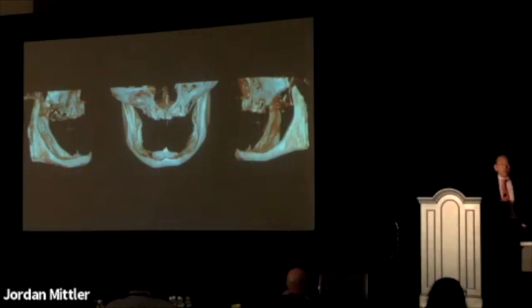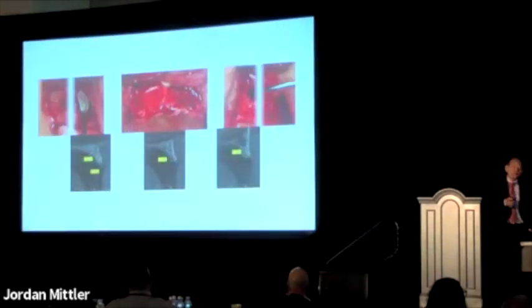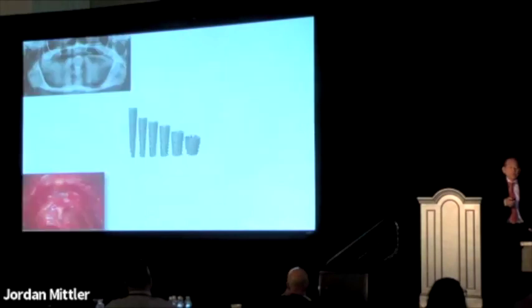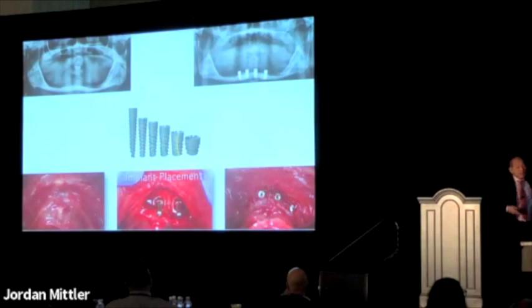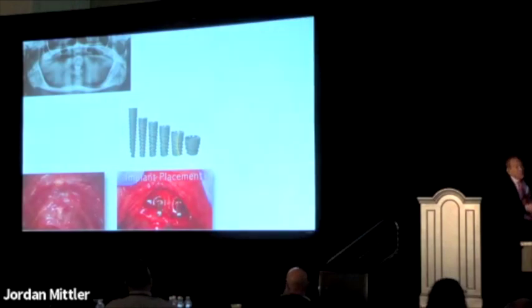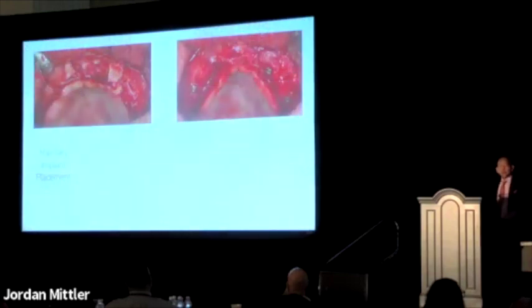Now, so to graft, but really, the patient doesn't need a graft. So of course I grafted the maxilla, but in the mandible, I'm going to place the shortest implant I can. What you see is that we just make a little nick in the gum, almost like flapless. I just placed 4 implants, I sutured. I did nothing else, and then immediately loaded the implants.